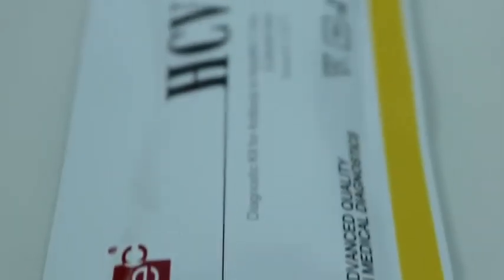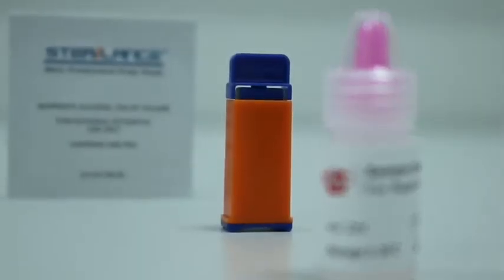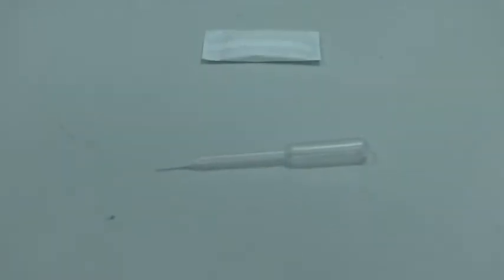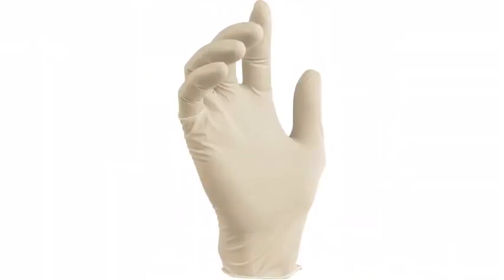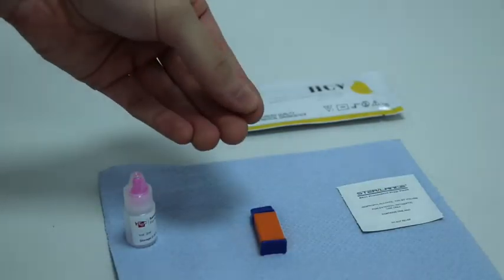Within the product packaging you will find several components included: instructions for use, a single-use safety lancet, a bottle containing chase buffer, an alcohol swab, and a small pouch containing the test cassette and a dropper used for sample collection. Please note that a timer and gloves are not provided within the box but are necessary for proper operation of the test.